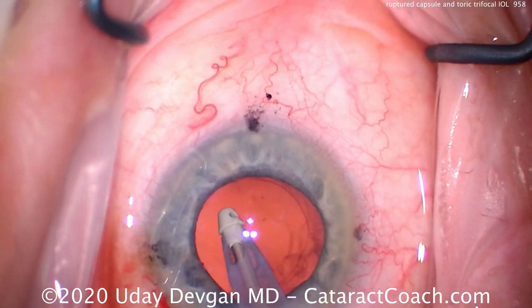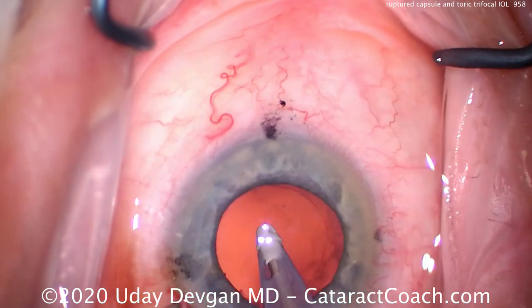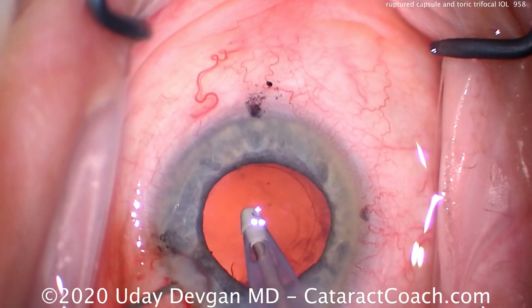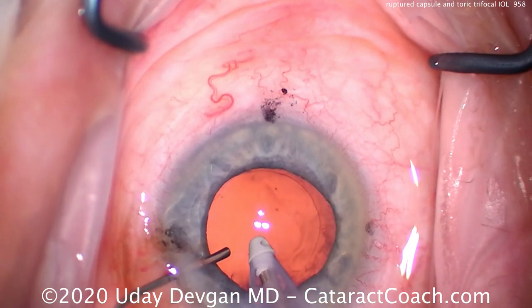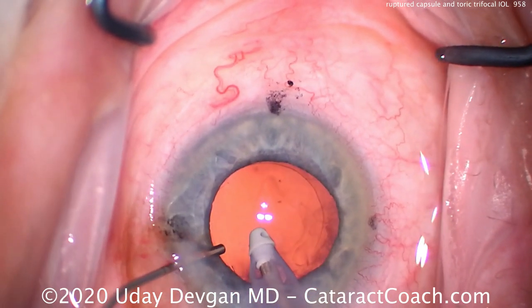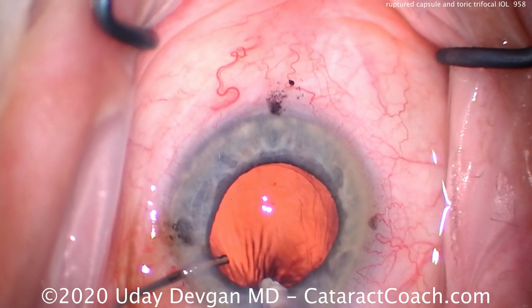We're going to show you this again in slow motion — there's that hole we made in the posterior capsule. Now we're going to put in some dispersive viscoelastic here, keeping the foot pedal on position one. Very important: don't let the eye collapse, so there's no vitreous prolapse at this point and we need to keep it that way.